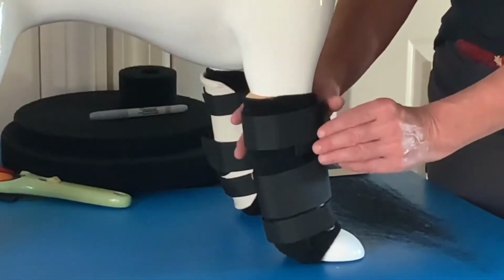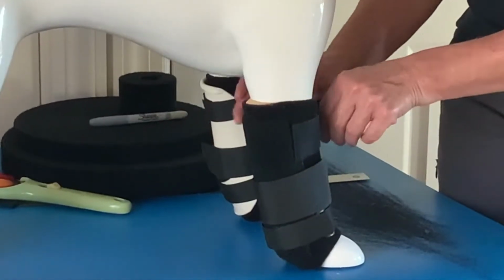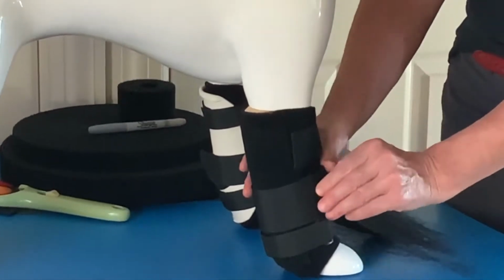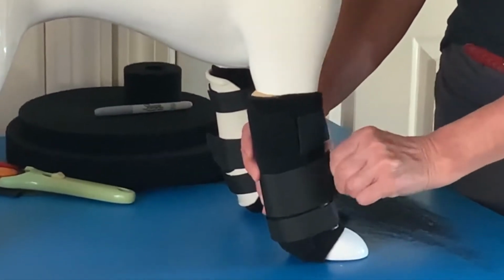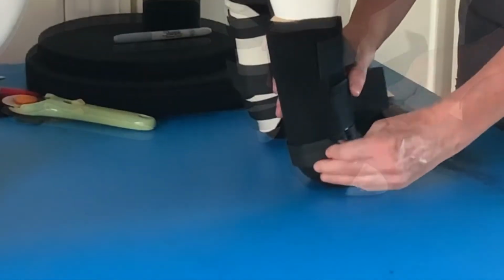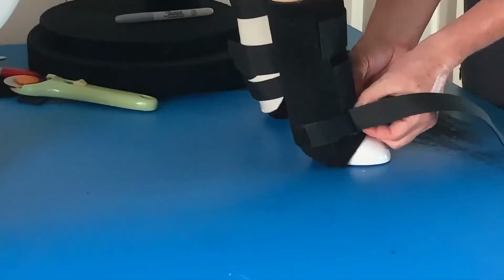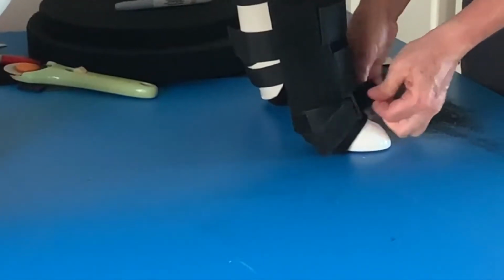This demonstration will show you how to make a custom-fitted neoprene carpal brace. Though an ideal brace would involve sewing down the components, you can create a custom brace without the need to sew. This is helpful if you need a fast solution or an interim brace while you wait for the custom brace or orthotic to arrive.